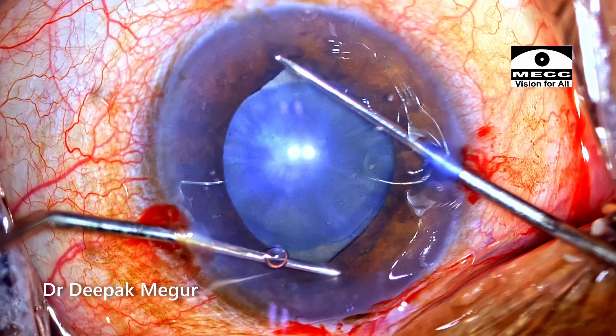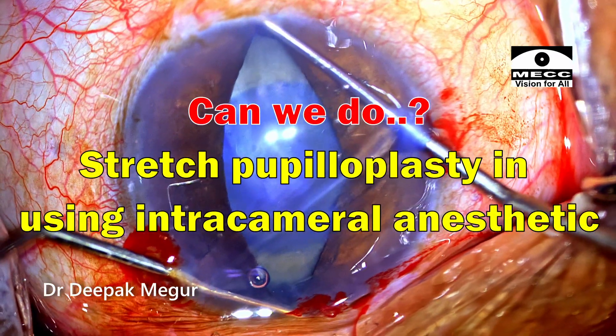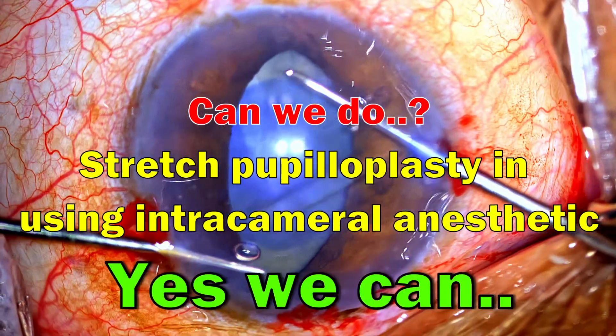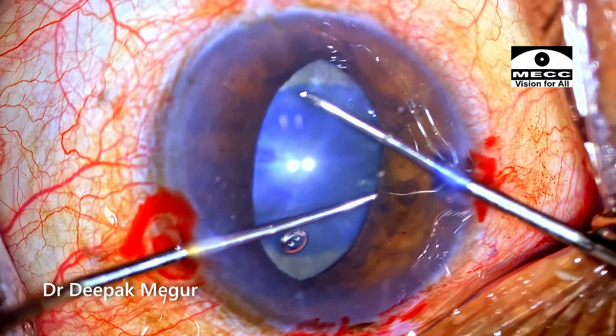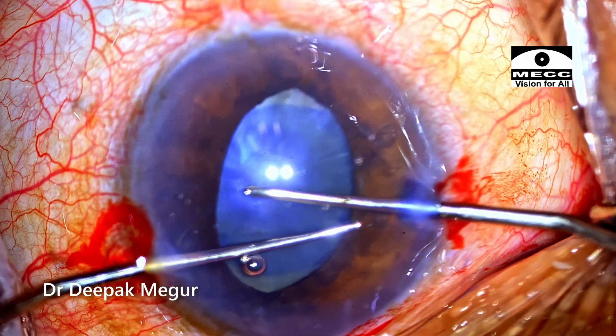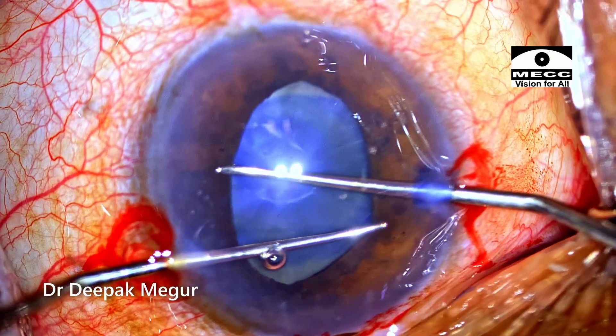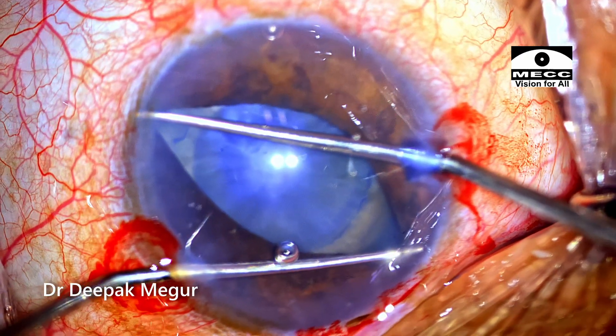One of the common questions I encounter is: can we do stretch pupilloplasty using just intracameral anesthetic? Yes, you can. In this clip, we can demonstrate that using just intracameral lignocaine, the iris can be manipulated and stretch pupilloplasty can be performed without causing any discomfort to the patient.